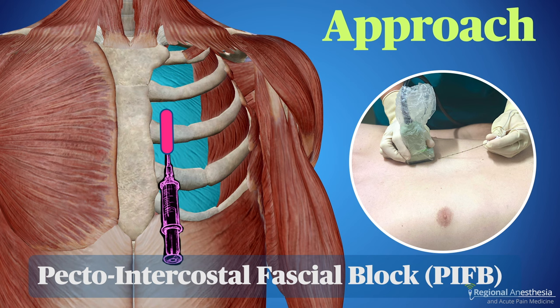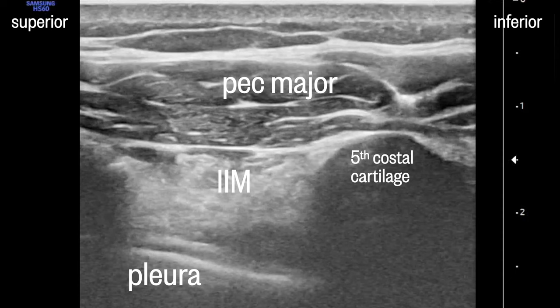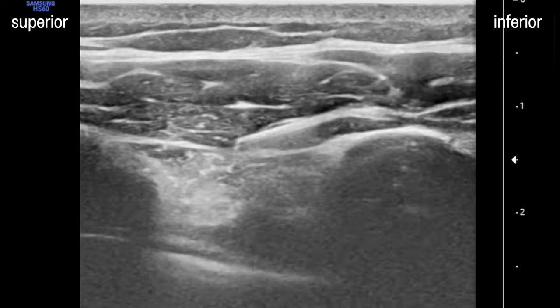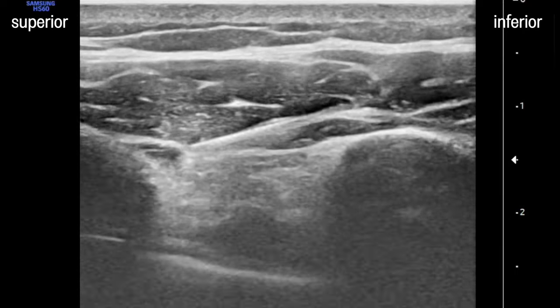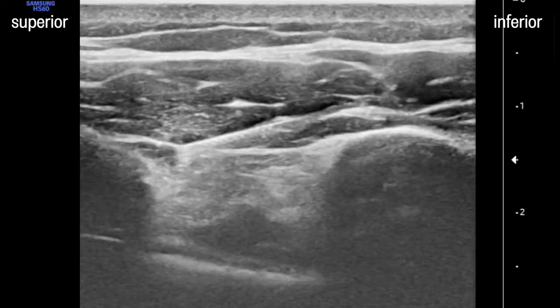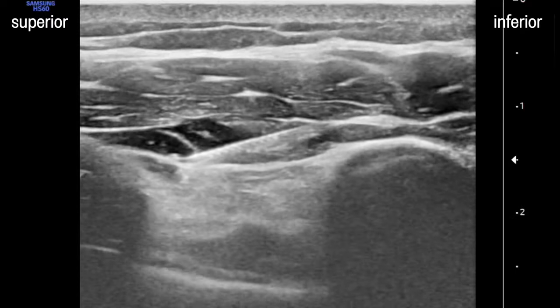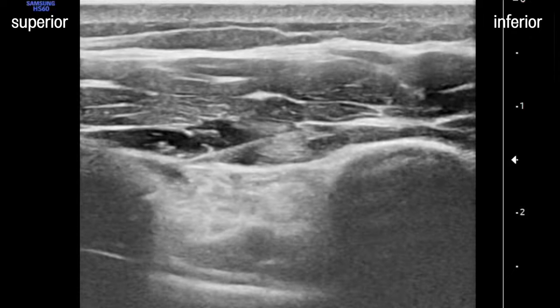With the pecto-intercostal approach, the aim is to advance a needle through pec major muscle until it lands in the plane between pec and internal intercostal, seen here in blue. The local anesthetic should spread between these two muscles and over the costal cartilages. It doesn't appear to matter whether you approach from the caudal or cephalad aspect. We see the needle coming from the inferior aspect here, and the local anesthetic lifting the pec muscle up off the intercostal. A good sign is the local spreading up over the humps of the cartilages.